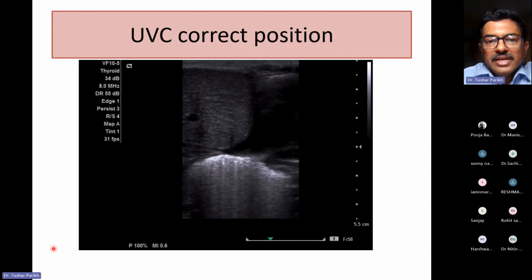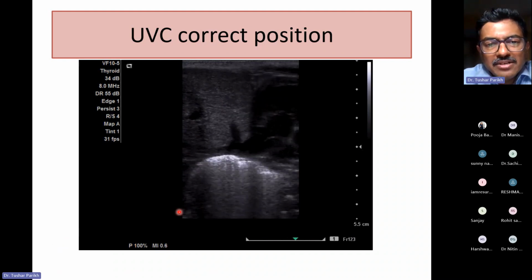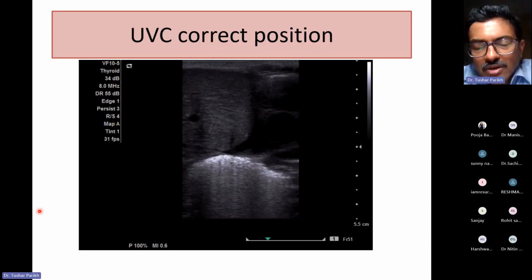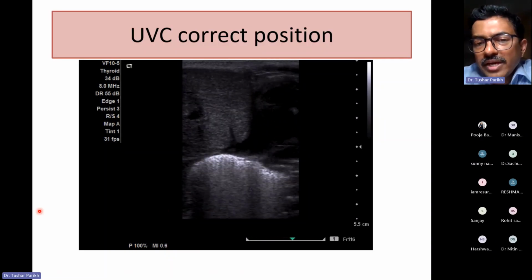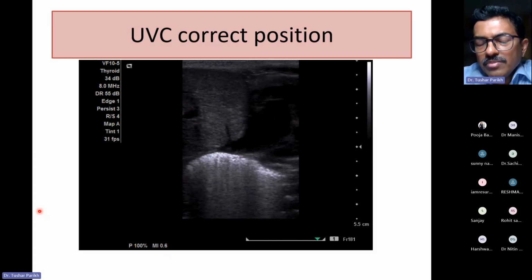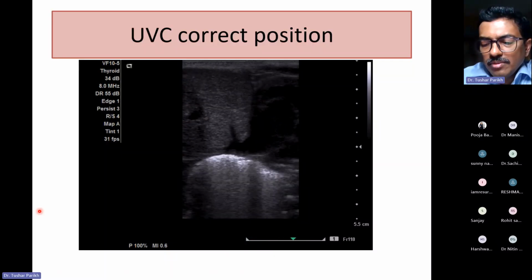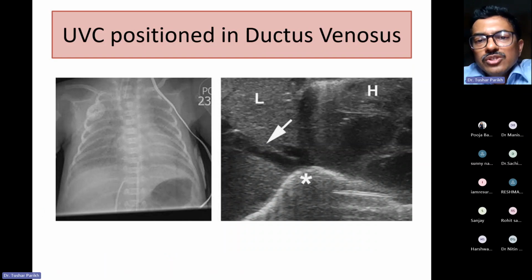It's real time, and you can trace it from here. It is there, and the tip ends here. As I already said, it is sometimes difficult to locate it. You require a high frequency probe, and sometimes you have to do movement or inject, and then you will be able to see the position. Now again showing you here. Here the UVC is positioned in the ductus venosus. Okay, so this is not the correct position, but it's an acceptable position.